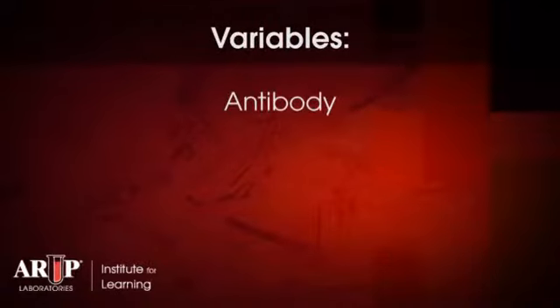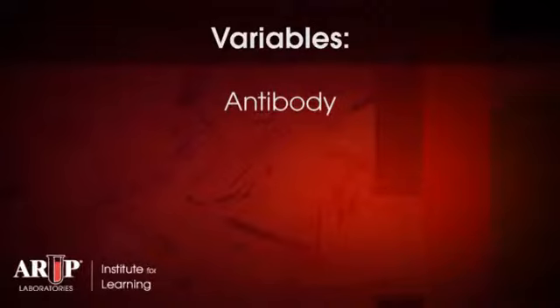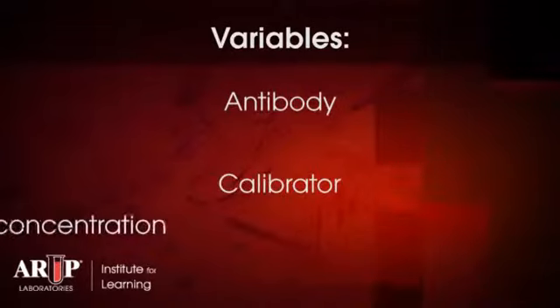Some of the variables that may contribute to false positive or negative results include the antibody upon which the test is designed, the actual design of the assay, the calibrator that's used, and the cutoff concentration.